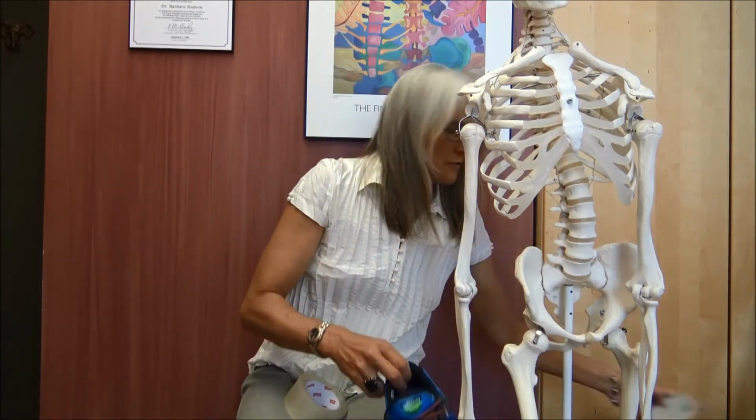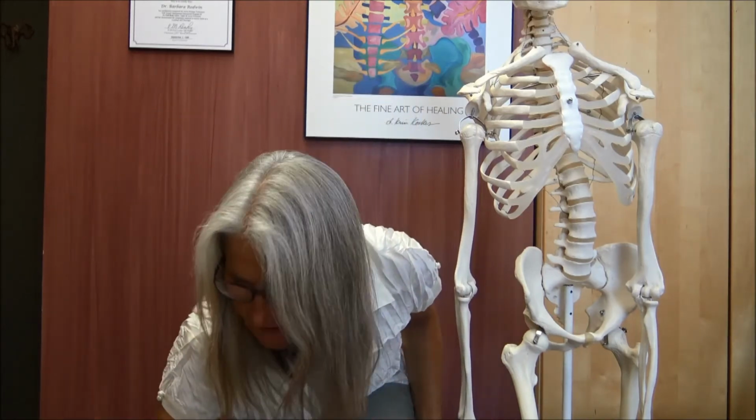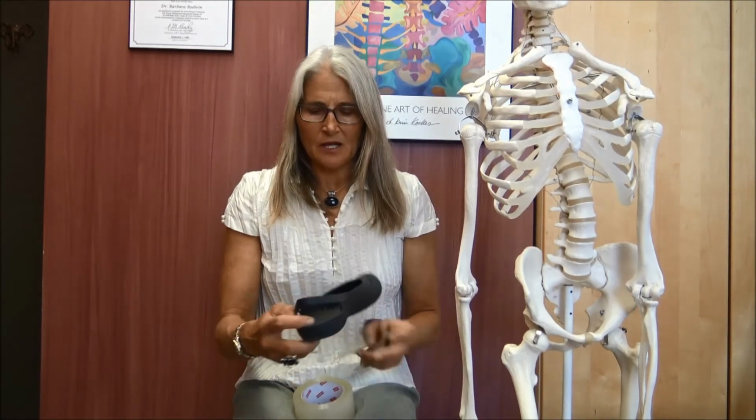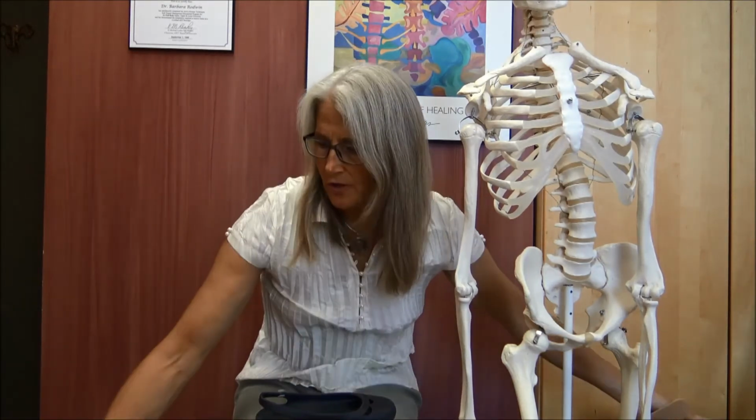Now with respect to heel lifts in other shoes, so women with dress shoes or sandals that open at the back, what we'd be looking at doing is using clear packing tape. You cut 2 pieces, which I've already done, and you roll them up. You place them on the bottom so that they cover just the bottom.